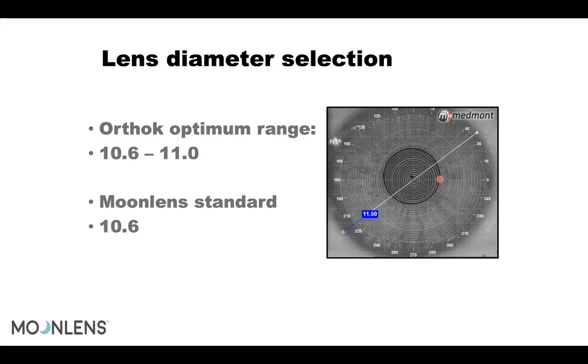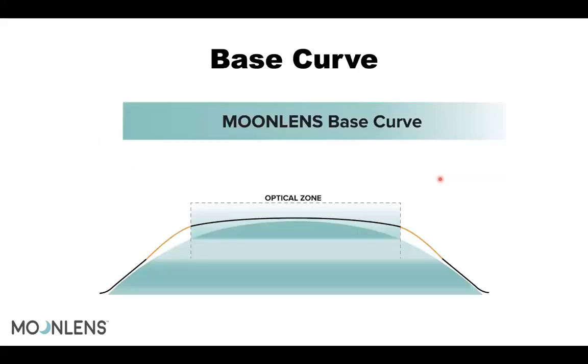to avoid more exchanges, right? Like I was telling you, there's an optical zone. For a regular RGP fitting, you would like to do the fitting based off the base curve, right? But just remember that in Ortho-k, you are not doing the fitting based on the base curve. You are doing it on the alignment zone.